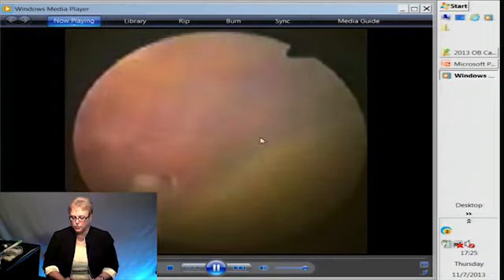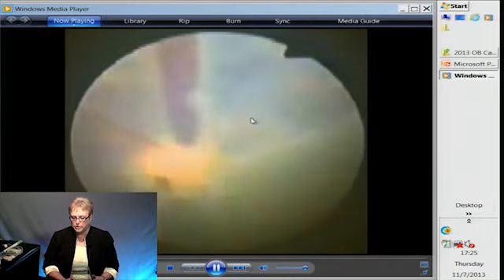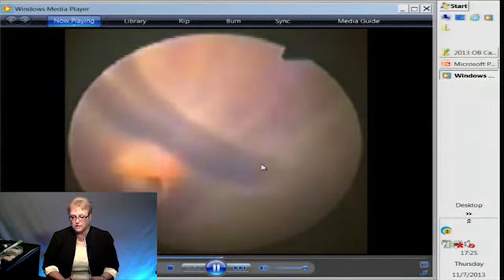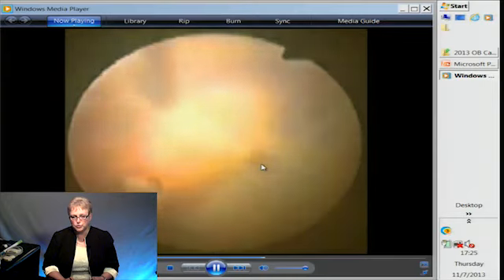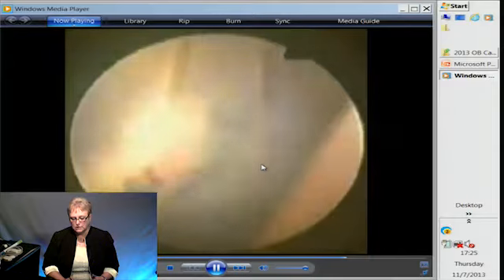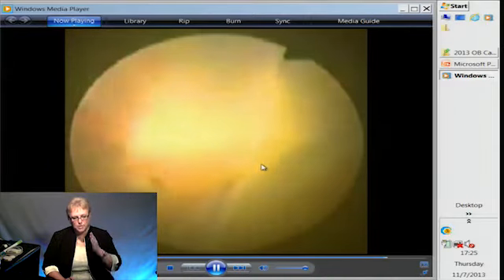So now this is right before they've mapped everything out. Now they're going to go in there and they're going to ablate it. So there's the laser. And really, it's hunting and searching. You're going through, you're trying to see these vessels, you're trying to zap the biggest ones. And then going back and making that equator.